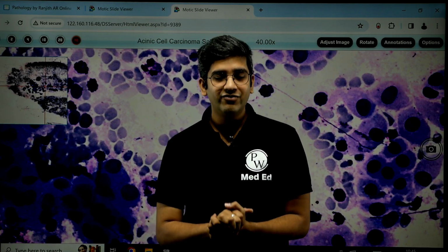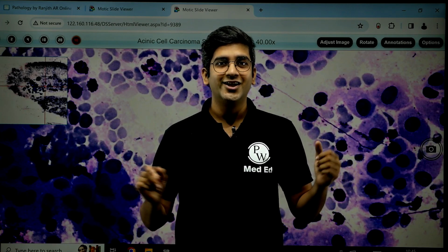I am very excited that PathoCubs has everything required for every pathology aspirant across the world to learn and to excel in pathology.